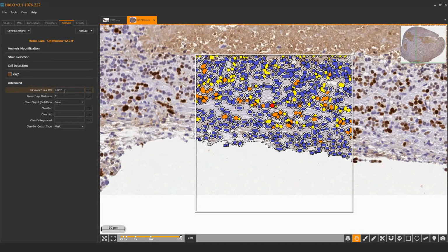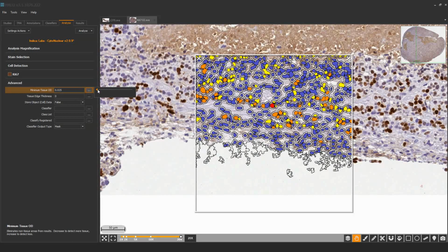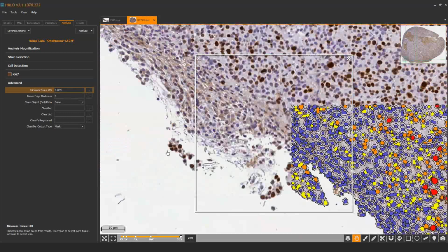What you get from this setting is an accurate quantification of tissue area. If you've got the tissue area accurately, then your number of cells per area or your number of RNA dots per area is correct. If this is inaccurately set, which I'll just show by decreasing, you see there the boundary is diffuse and we don't quite know where the tissue is beginning, then your area of tissue will be incorrect. So it's better to have that accurately set. In most cases, this default value works out of the box, but the exception will probably be Zeiss images.